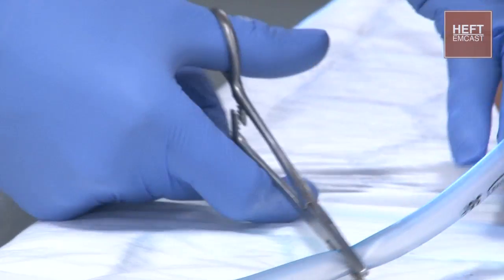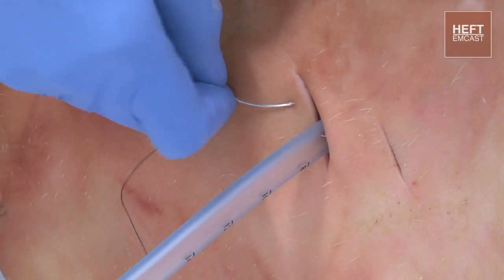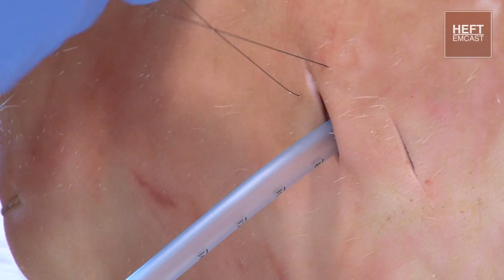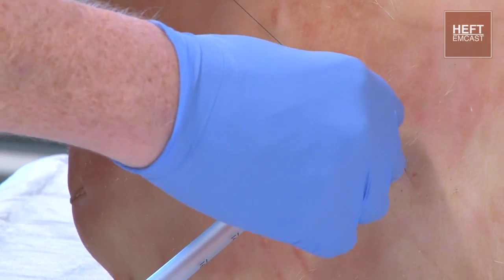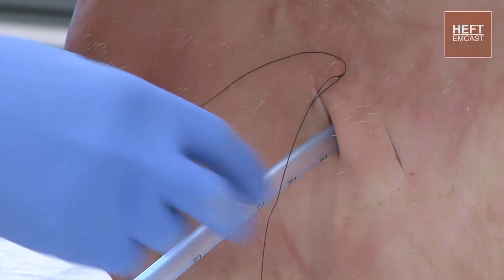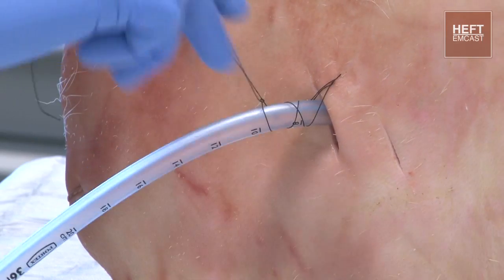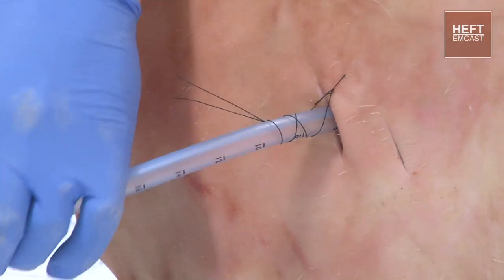We're then going to stitch the drain into place. Start off just by taking some skin and anchoring that into place. It might be an idea to remove the needle at this point — put that aside — and then do several wraps around the drain to secure it in place.